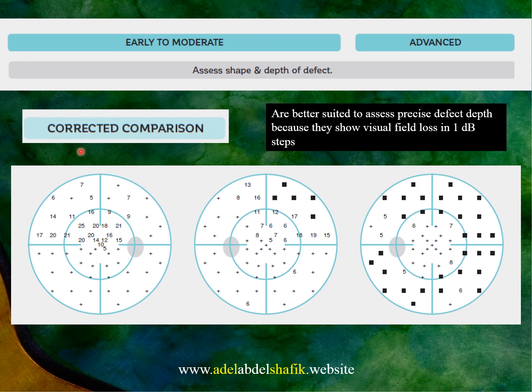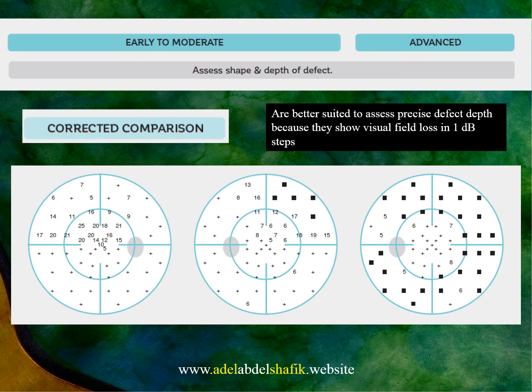In the case of Octopus, if you check the corrected comparison printout you can identify some changes for early, more extensive changes for moderate, and dark spots representing absolute scotoma for severe — all just from the visual appearance of the printout.